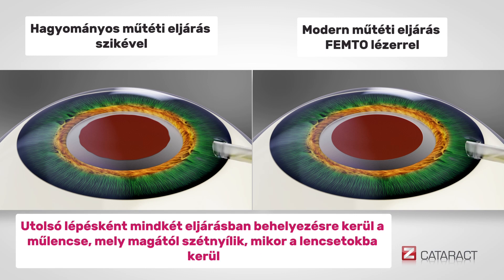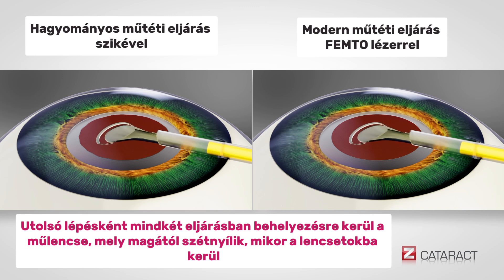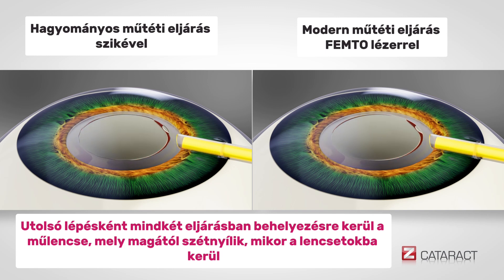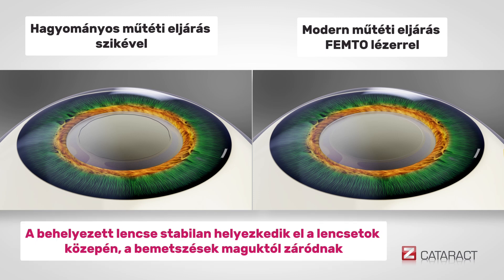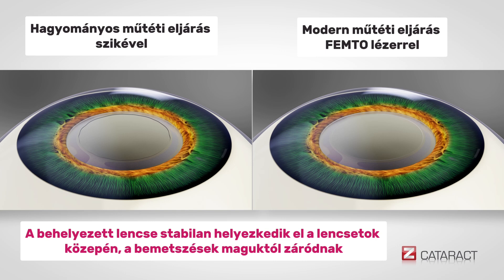At last, in both procedures, the transparent artificial lens is carefully inserted. The lens unfolds within the capsular bag, taking the place of the extracted natural lens. The implanted lens remains fixated at the center of the eye, remaining completely imperceptible. The incisions seal themselves automatically.